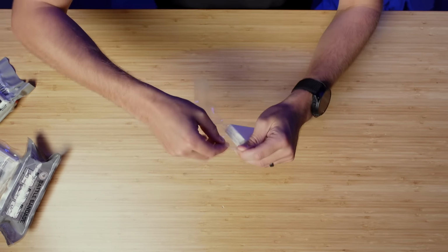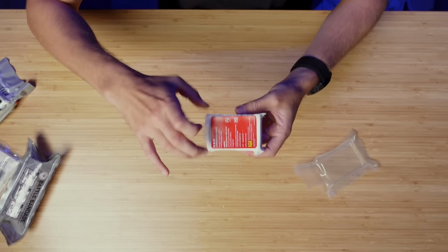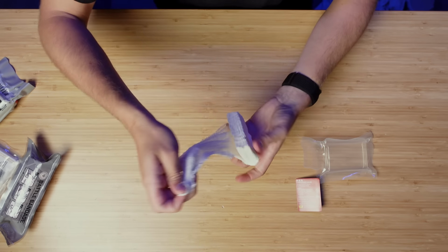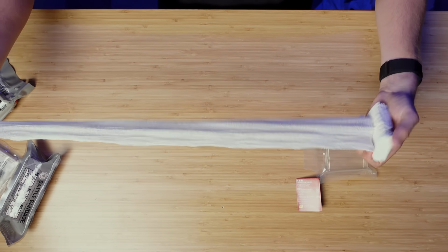Now this, or compressed gauze here. Now this here, we open it and it's very similar to the other gauze. It just has a little informational sheet there. Once again, kind of hard to find the end, and it will just unspool just like this. And you get a lot of it. So you get the idea with those.